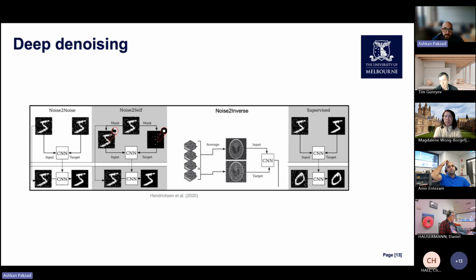And this final one is easier to apply in the reconstruction domain just by reducing the number of projections as we have, and performs typically the best compared to, for example, unsupervised, where you don't have a reference for a higher dose.